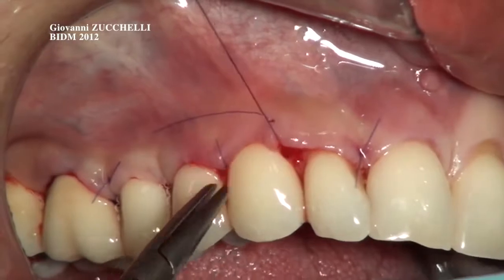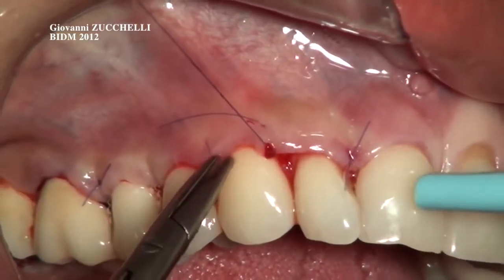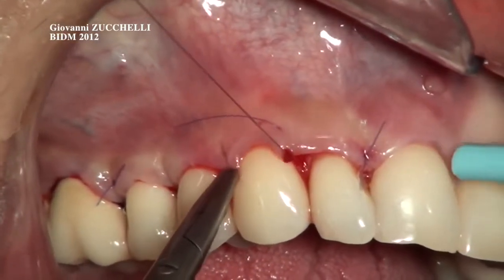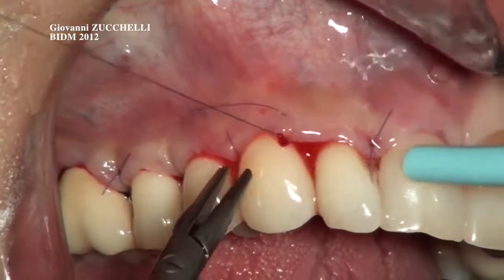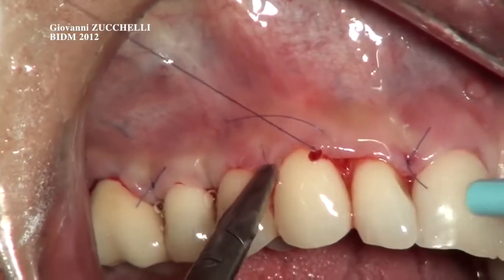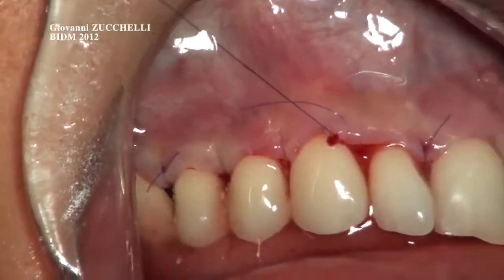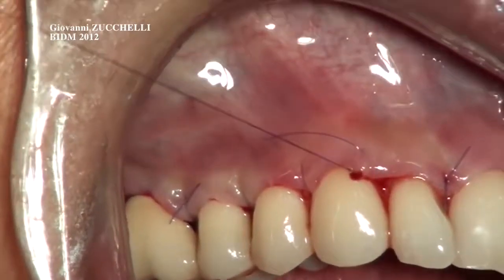And before closing, you have to check for the good adaptation of the surgical papilla above the anatomic papilla, where you don't have the knot, like in this area. It's completely out. Okay, close. Down.